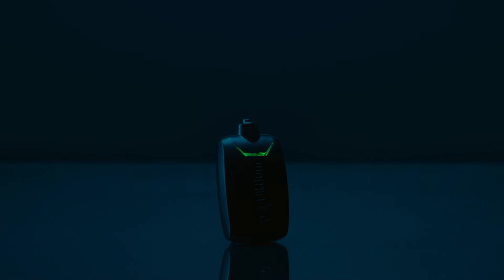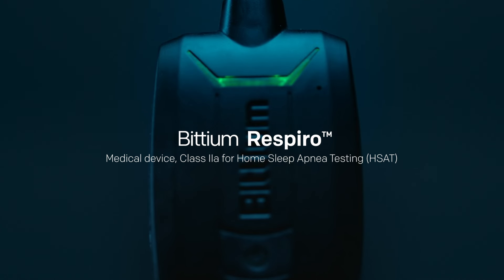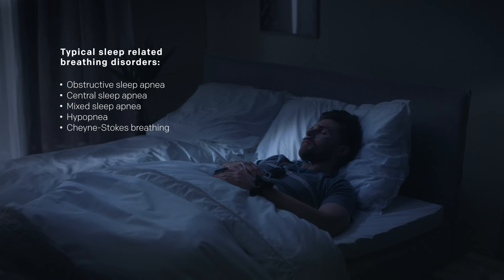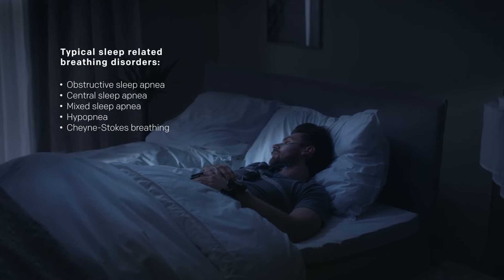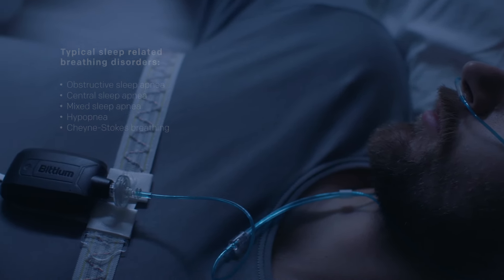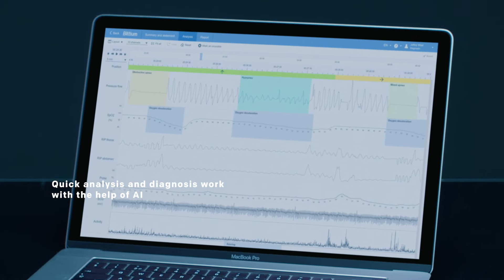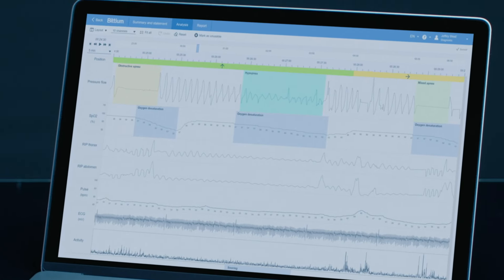Bittium Respiro is a modern sleep apnea ambulatory recording device and analysis service solution for service providers, hospitals, clinics, and health centers. It is focused on home sleep apnea testing and is intended to record standard PG-level data and analyze typical sleep-related breathing disorders. With Bittium Respiro analysis software, the measurement data is pre-analyzed by using artificial intelligence to accelerate analysis work.